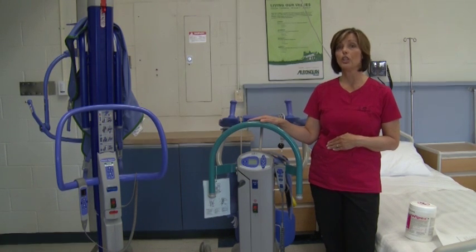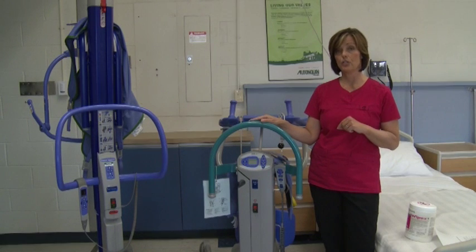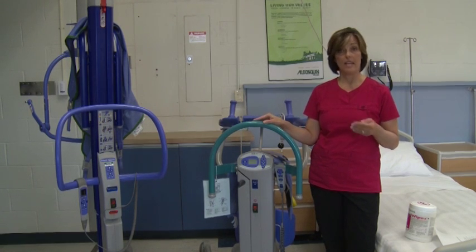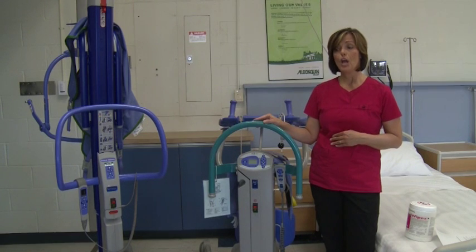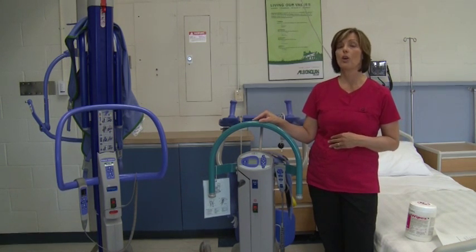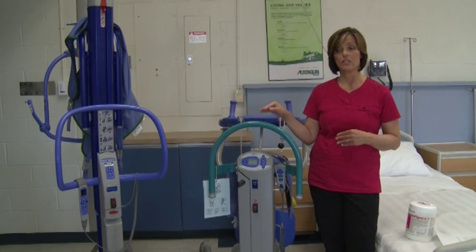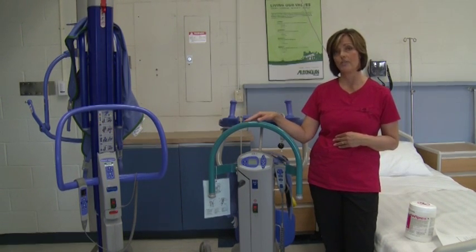What's also important to know is that when you're out in clinical, agency policies usually demand that one of the two individuals using the lift is an employee of the agency itself. So for example, if you are placed on a clinical unit, you cannot ever transfer a client with your instructor from the college or with a student. The use of a mechanical lift always requires an employee.